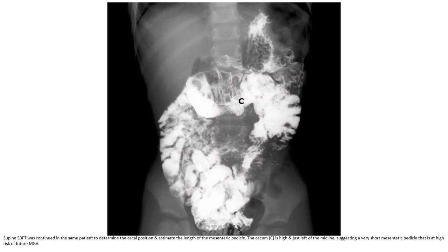Small bowel follow-through was continued in the same patient to determine the cecal position and estimate the length of the mesenteric base. The cecum is high and just left of the midline, suggesting a very short mesenteric base — a high risk for future midgut volvulus.